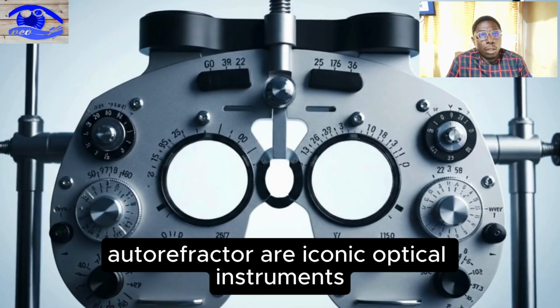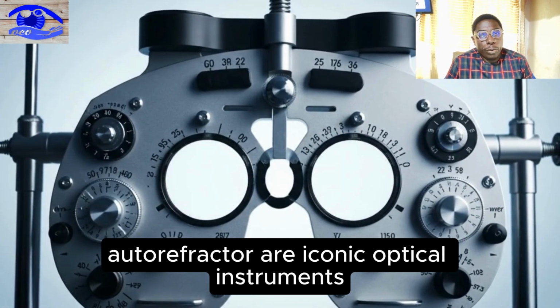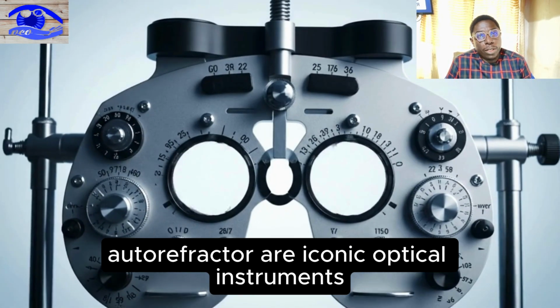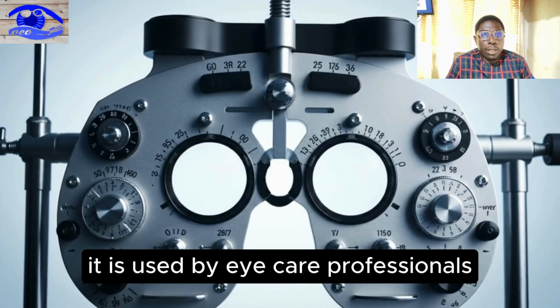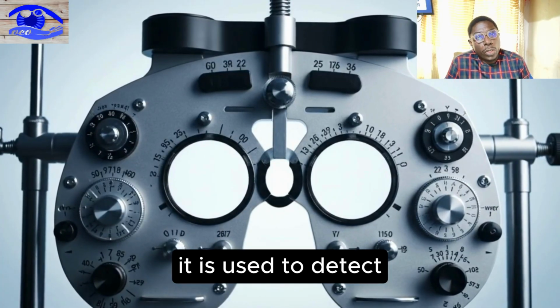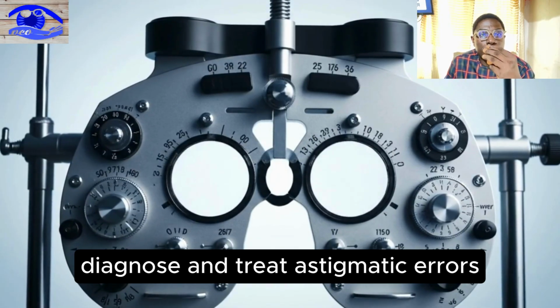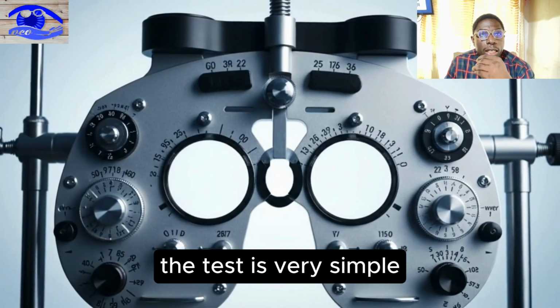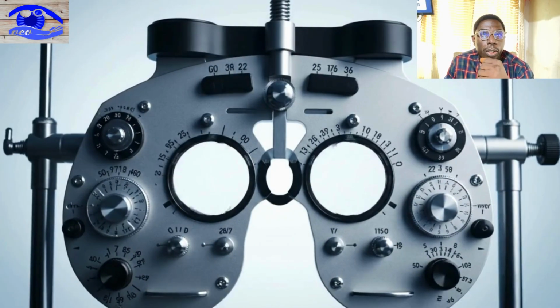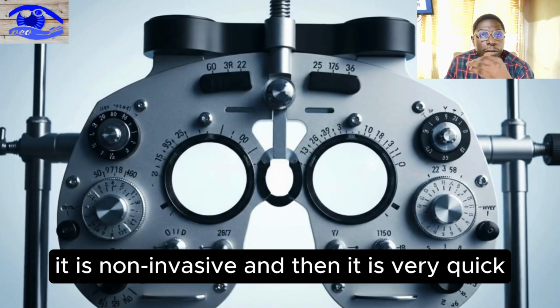Phoropter and autorefractor are iconic optical instruments. They are used by eye care professionals to detect, diagnose, and treat astigmatic errors. The test is very simple. It is non-invasive, and it is very quick.